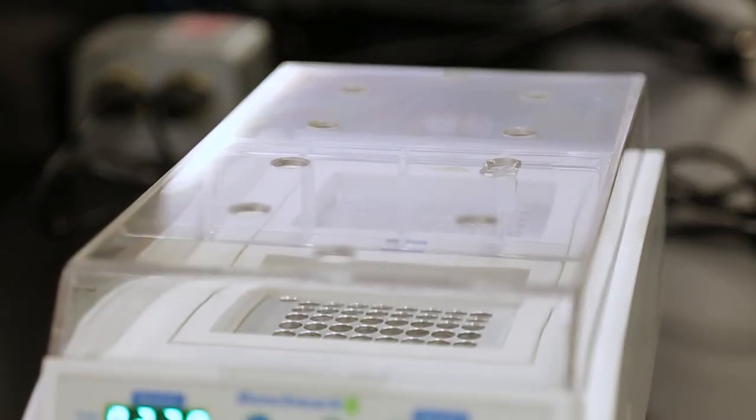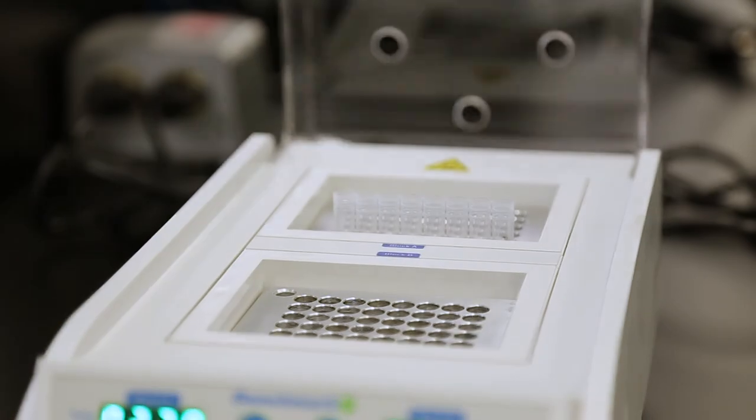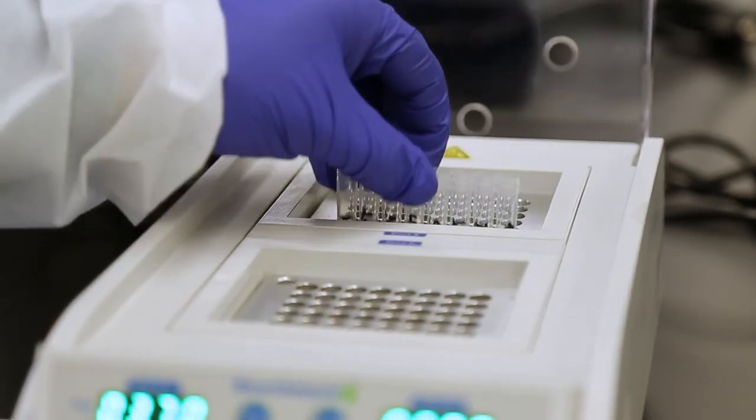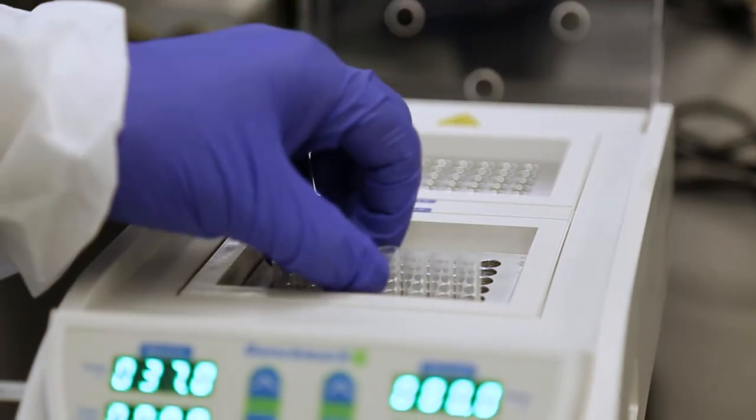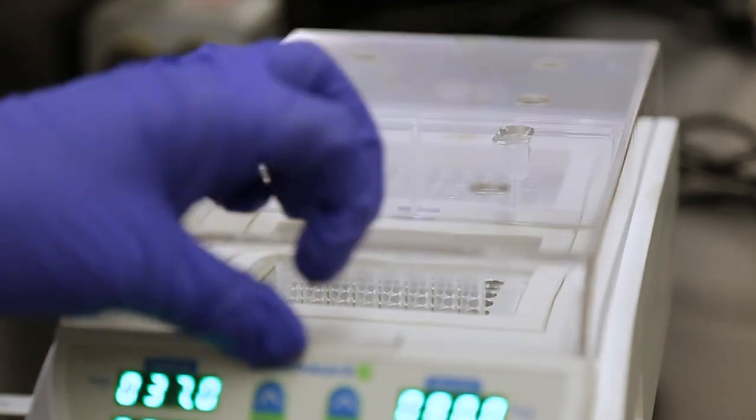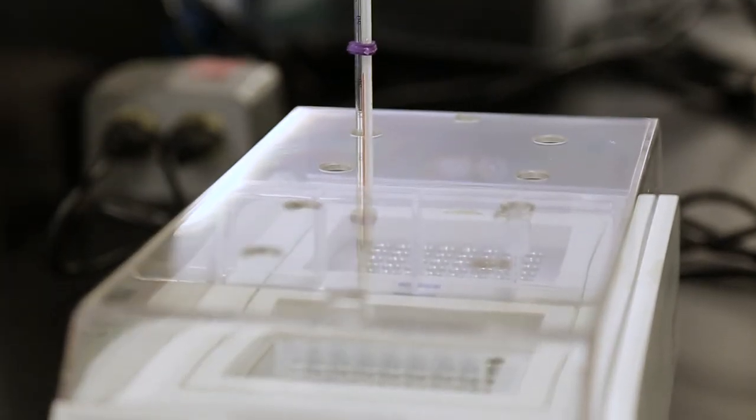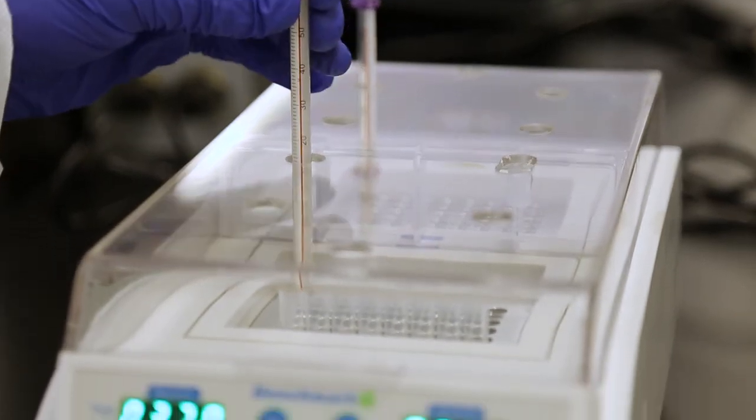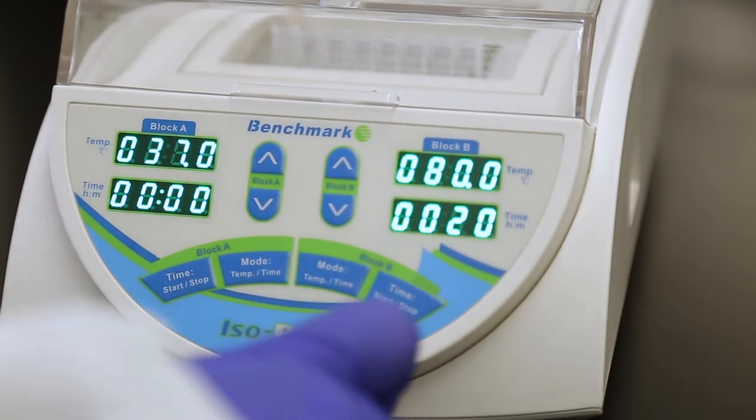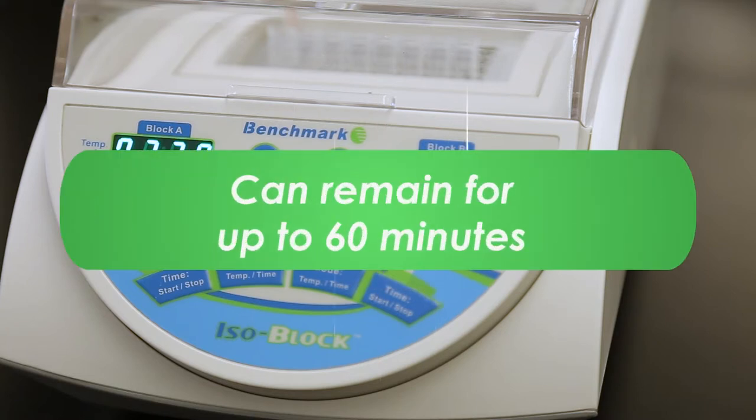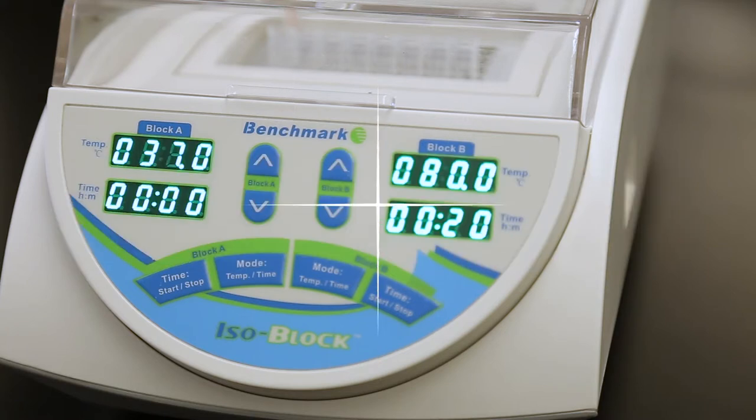After the 10-minute incubation is complete, remove the thermometers, if you place them back in, and immediately open the lid and move the cluster tubes to the 80 degrees Celsius block. Close the lid, and if you like, return the thermometers. Then, start the block B timer you set to 20 minutes. The cluster tubes can remain in this block for up to 60 minutes.